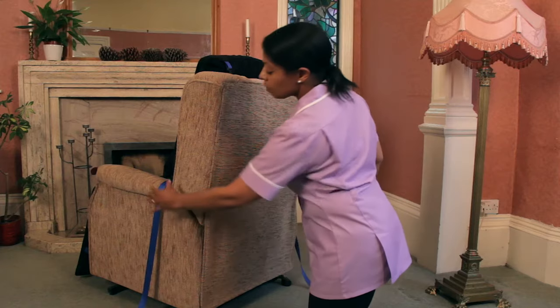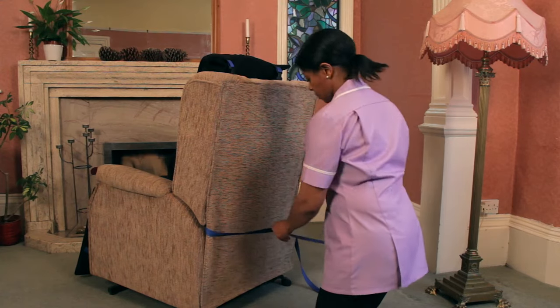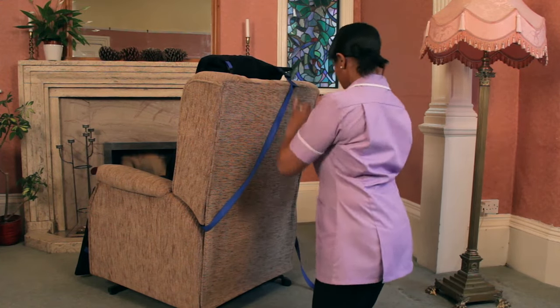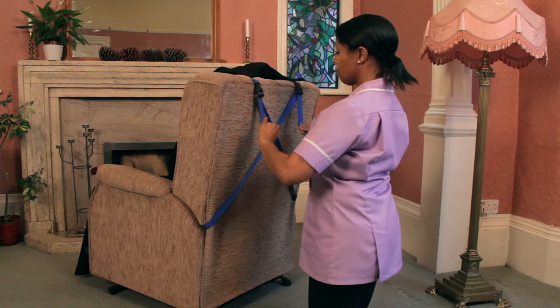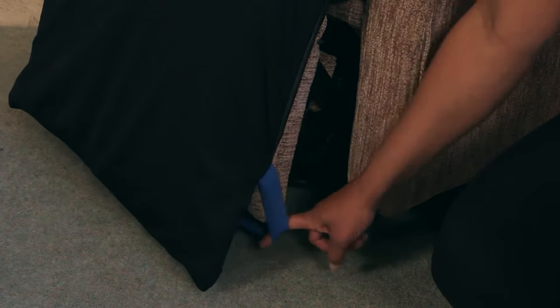To attach to the chair, first insert fixing straps between the seat and armrest, looping around the back of the chair. Cross fixing straps as shown, then loosely clip the fixing straps into place. When both straps are clipped into place, adjust until secure. Loop the bottom fixing straps around either side of the footrest until in place.